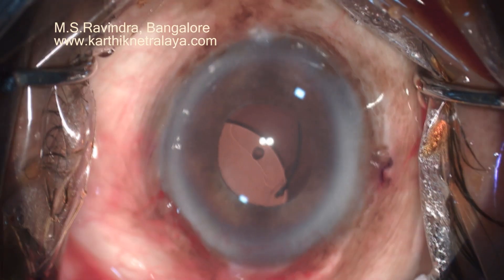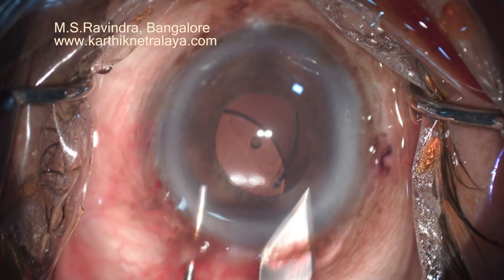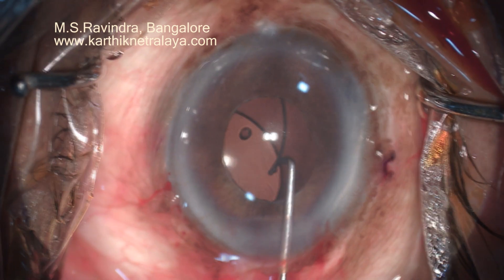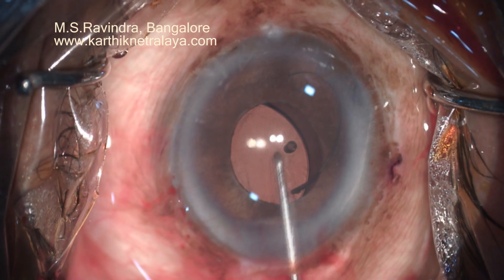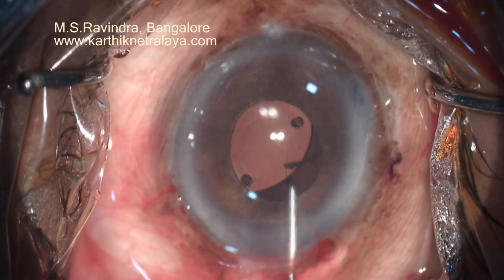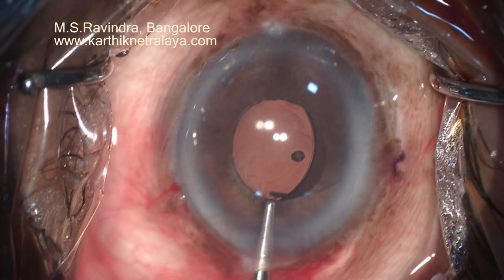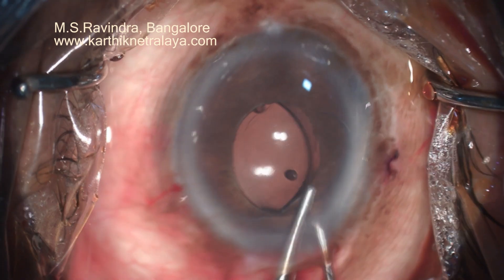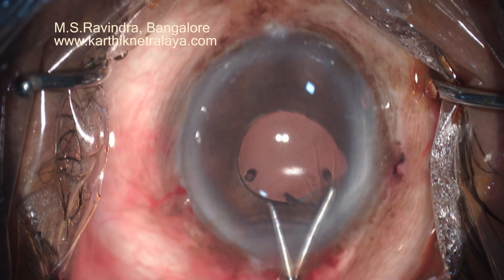Two paracentesis entries were made at 12 o'clock and 6 o'clock, and a temporal tunnel was created — translimbal, starting from sclera — without a separate conjunctival incision, going across the limbus and adjacent cornea. The 2.8 mm incision was enlarged to 6 mm to facilitate removal of the PMMA lens.